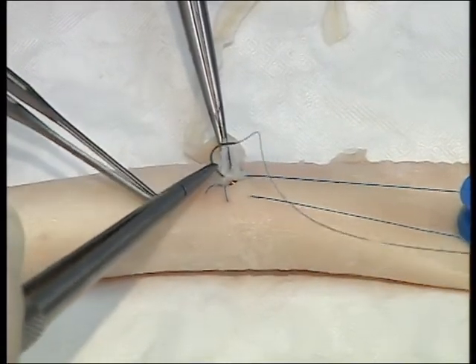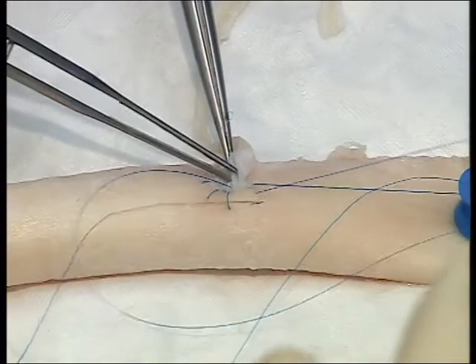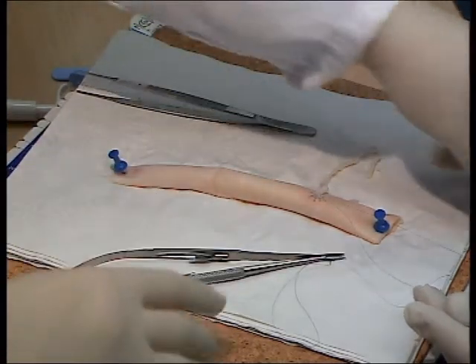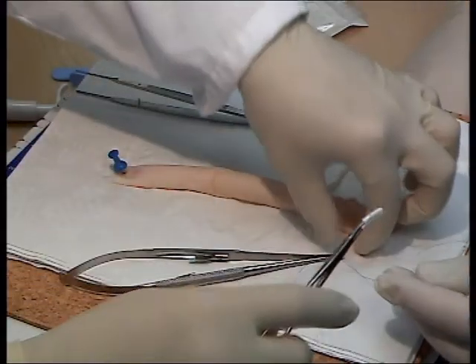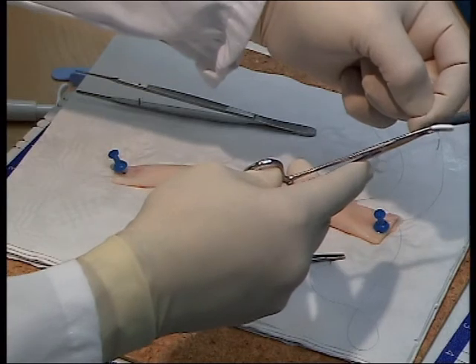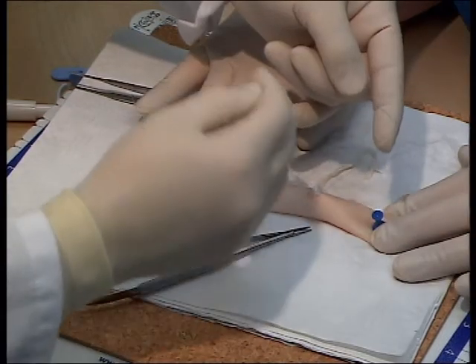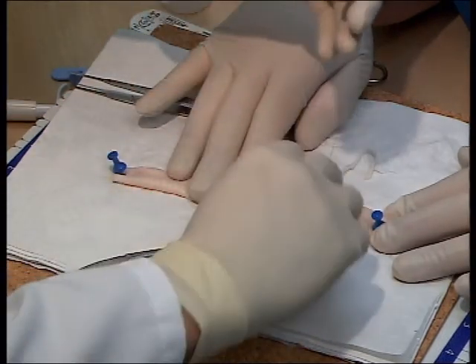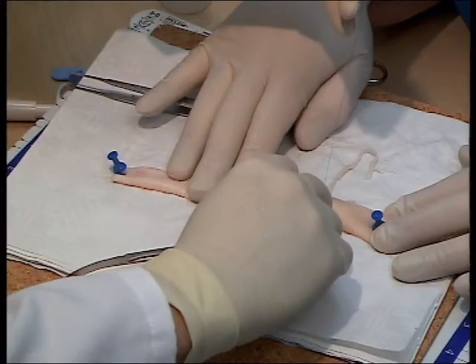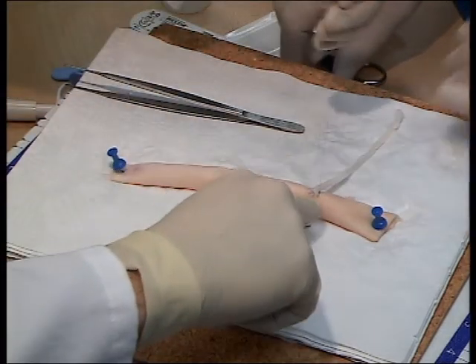At all times, ensure that you are able to see the smooth passage of the needle from conduit through the full thickness of the aorta. When you reach your starting point, secure the anastomosis with a knot. When you tie your knot, attempt to do so in such a way that the knot lies on the outside of the aortic wall and doesn't fall into the anastomosis.